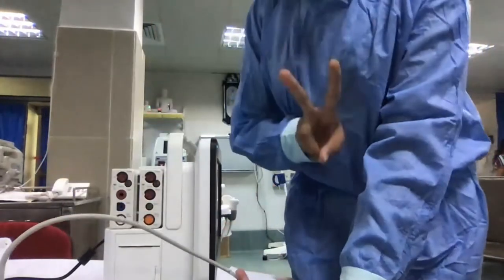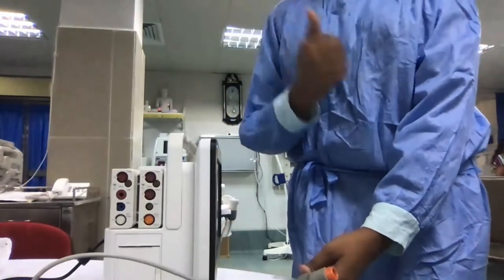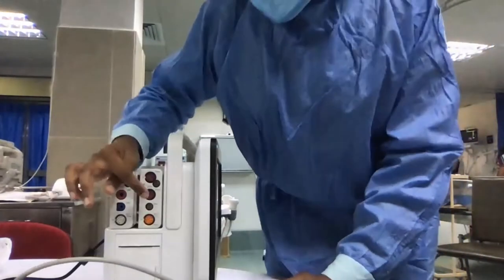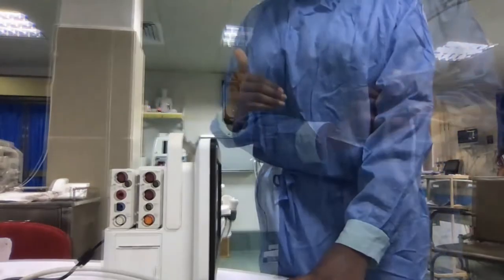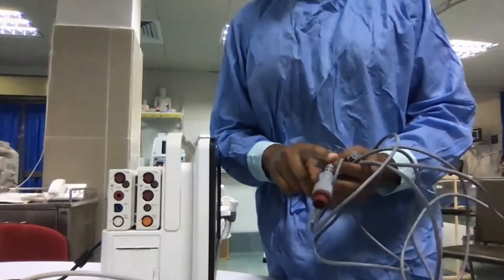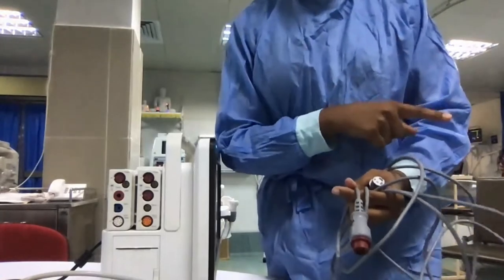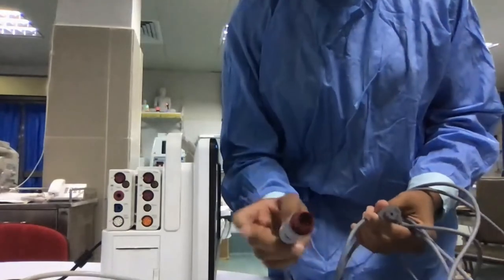And then we need two invasive pressure monitoring lines, one for the CVP and the other one for the arterial line. You can see all the red color ports are for the arterial invasive pressure line. This is the IBP cable. As far as I remember, you can use the same cable that you are using for MindRay as well.